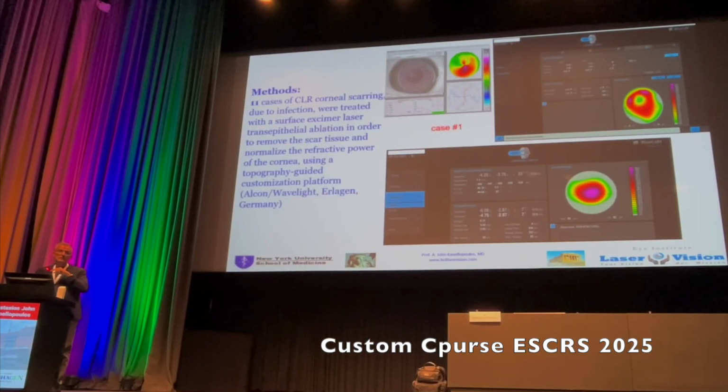C4 will be 0 here. So if you start adding myopia, not in quarter diopters, but 0.05, 0.1, 0.15, you reach a point where C4 and C12 are the same. And that is the myopia that this treatment is planned to induce. So you want to add this to your treatment regimen, to your refraction.